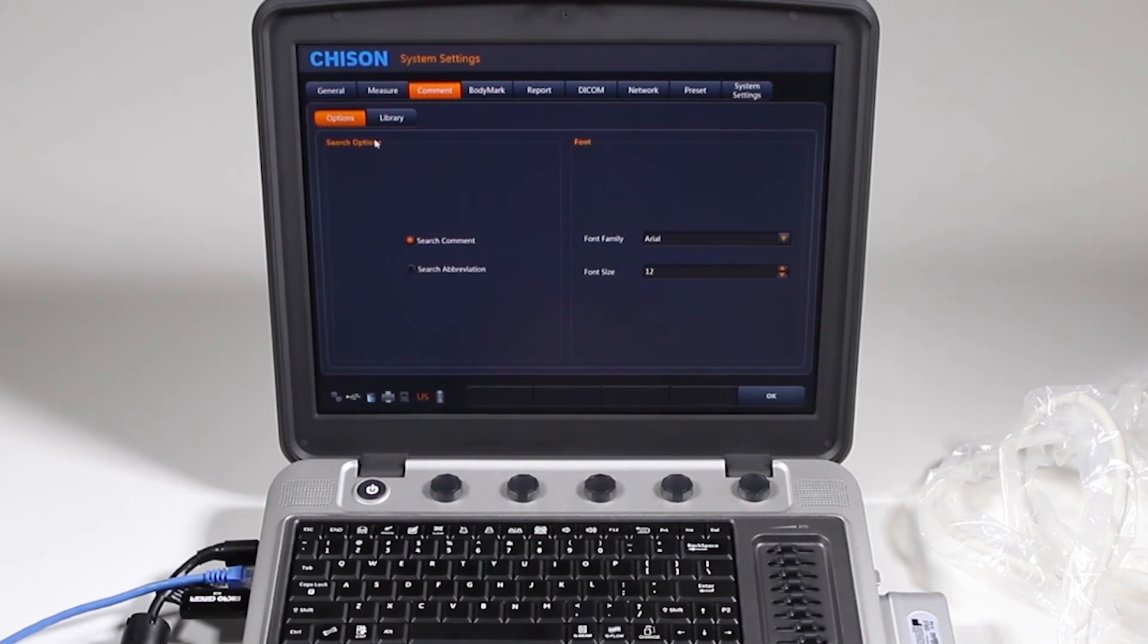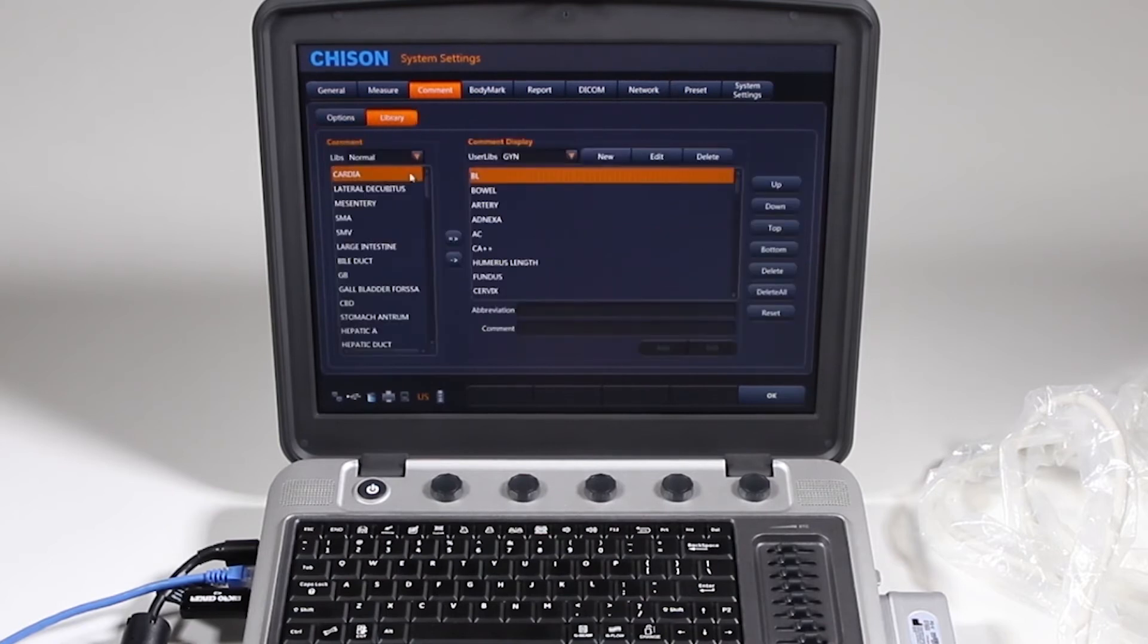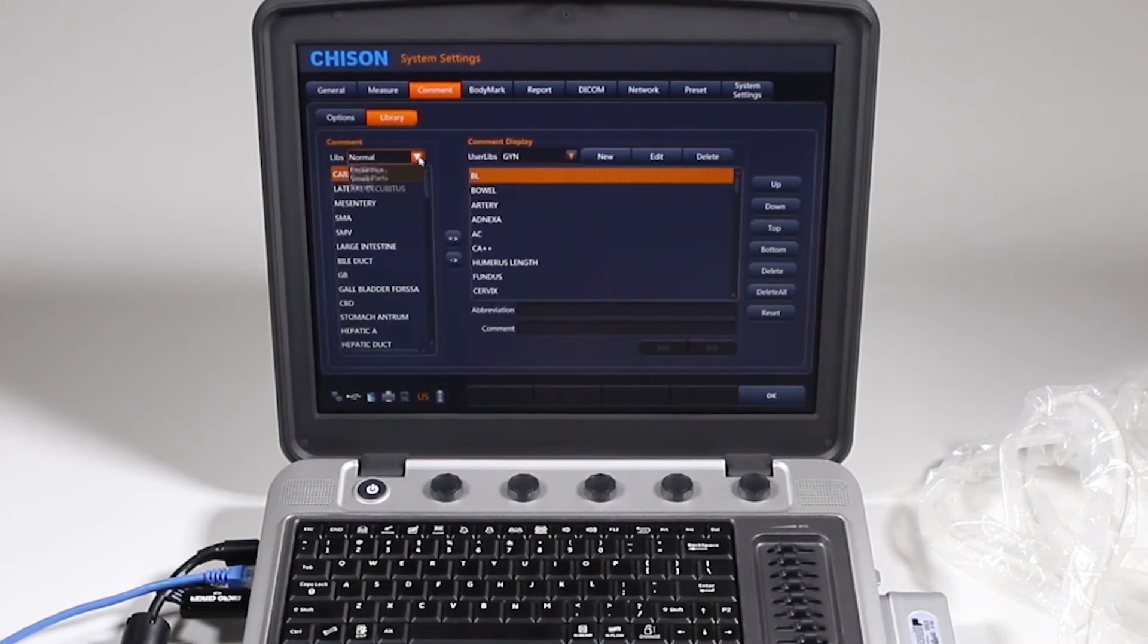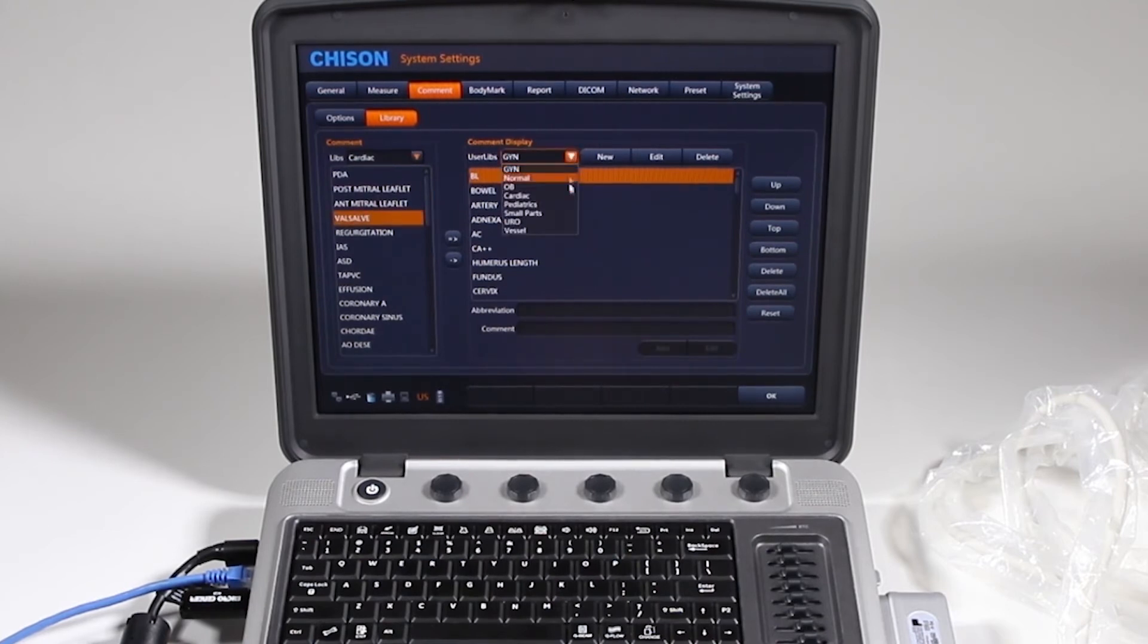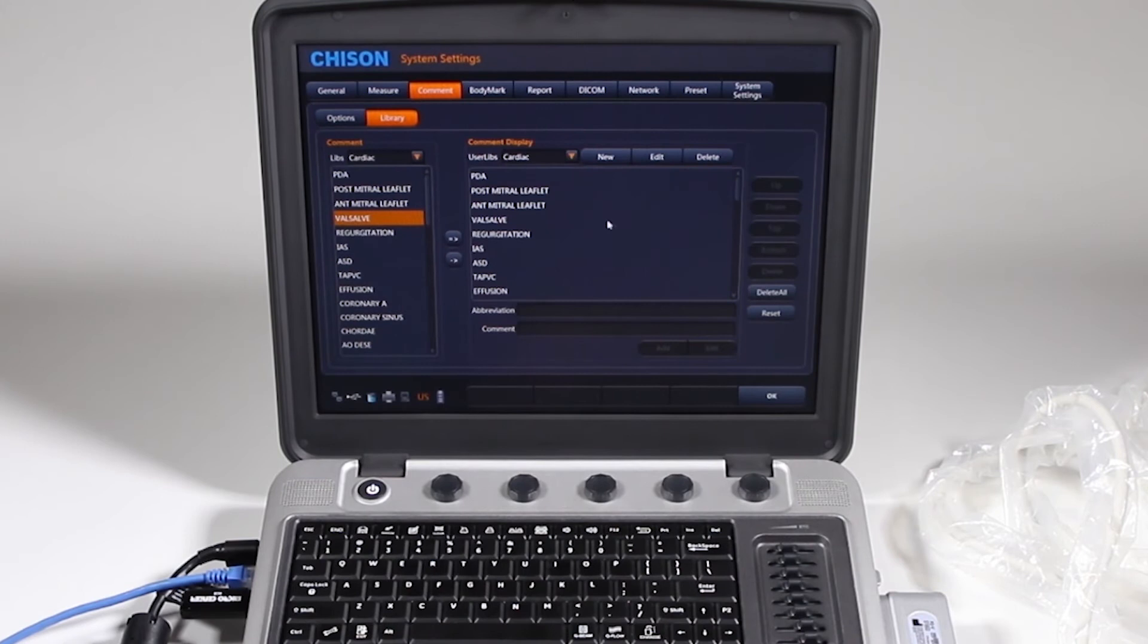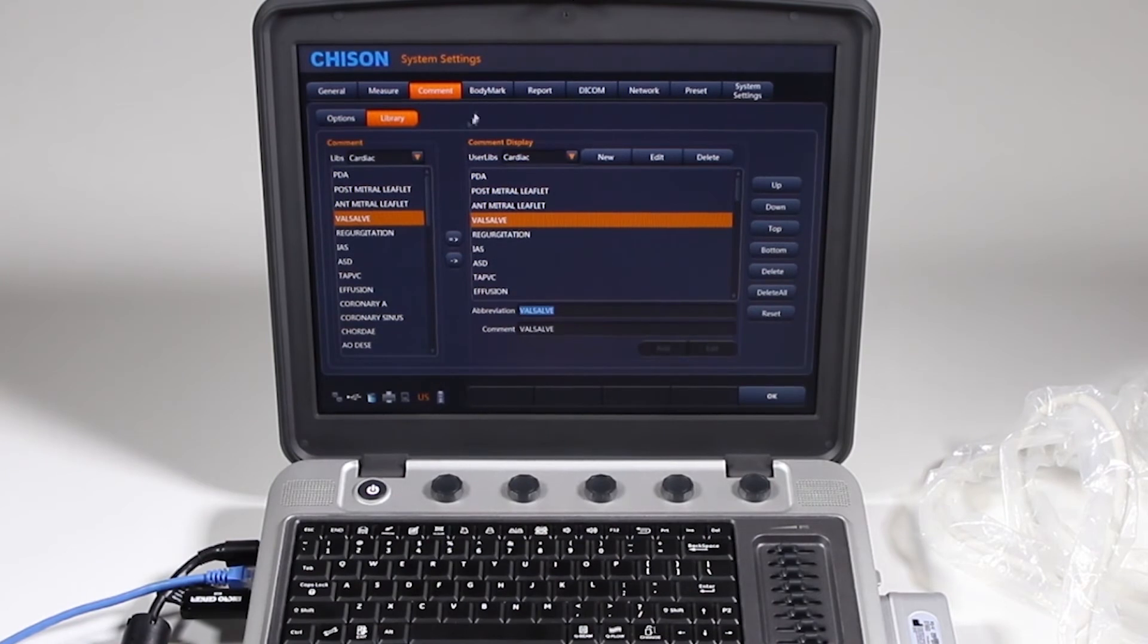Comments, you can, here's how you want to, when you search for a comment, the font size, if you want to add or remove to your library. Your library are here, say cardiac, here's what's available, and what you want to display on there. You can move them up to the bottom, down, delete them, and change your comments or abbreviations.